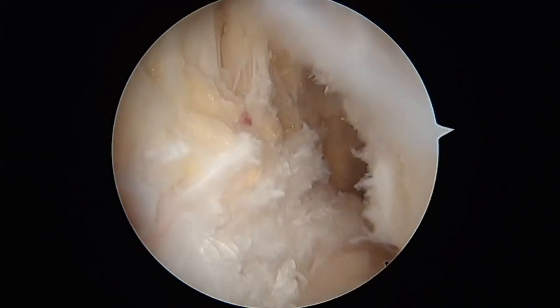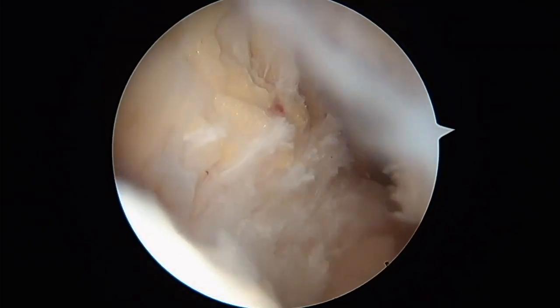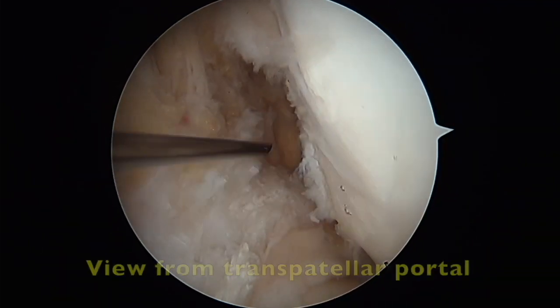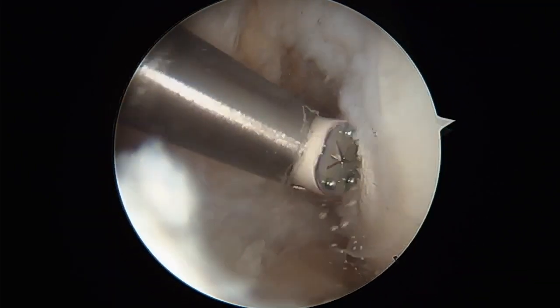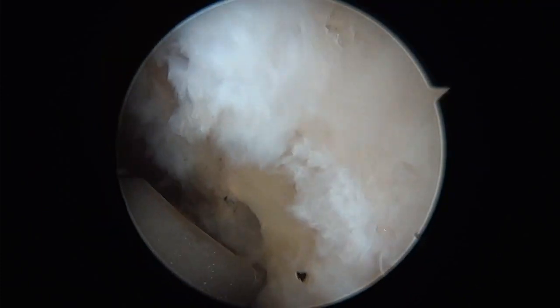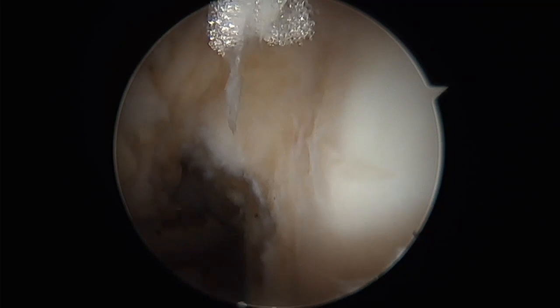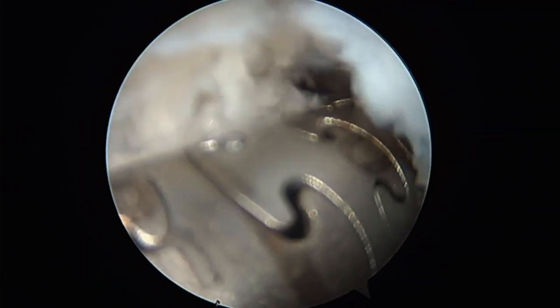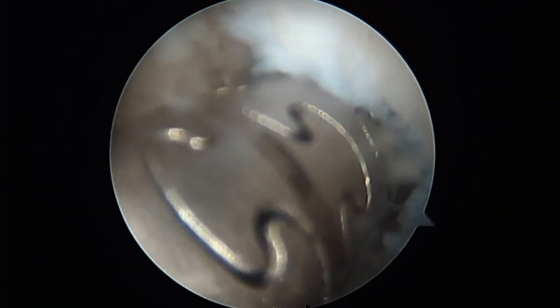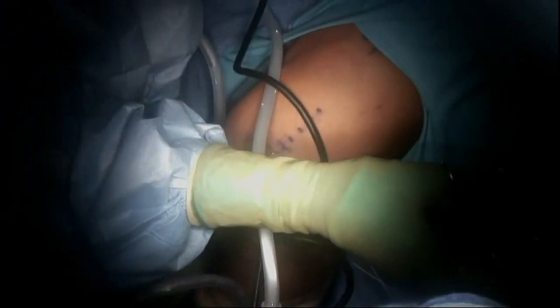In this video we demonstrate the view from the anterolateral portal. A transpatellar accessory portal may also be employed as an additional viewing portal for the femoral insertion site of the ACL and the intracondylar notch. Although no reconstructions can achieve true anatomic and isometric positioning, more recent studies have described how anatomic placement of the femoral tunnel, positioned slightly anterior to the center of the anteromedial and posterolateral bundles, was the most isometric. When reaming through the desired location of the tunnel, the knee should be in about 110 to 120 degrees of flexion. Here we demonstrate drilling of the tibial tunnel with suture passage using a flip cutter.